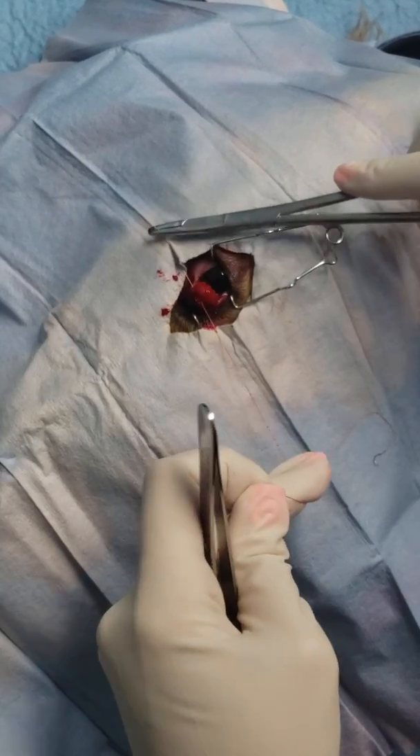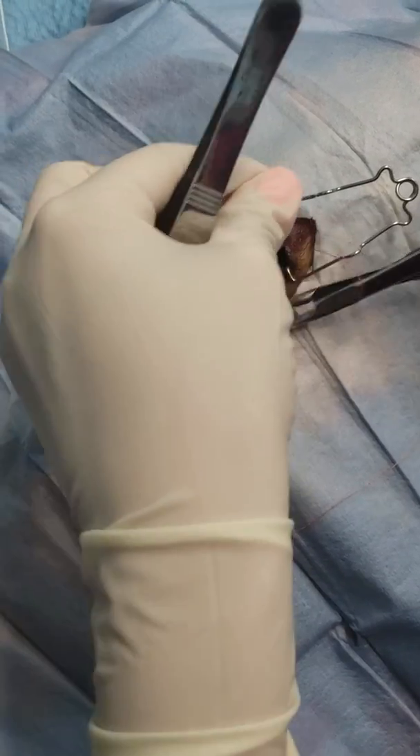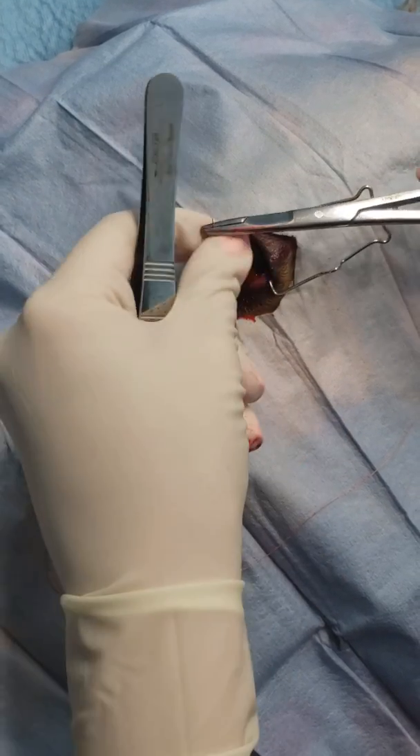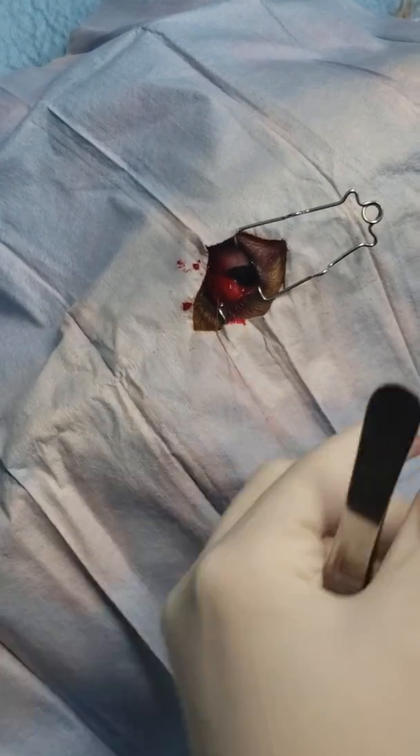And then we tie our knot. I do apologize that this is white suture — I really hope you can see everything. We want to cut that knot really short to help it bury.